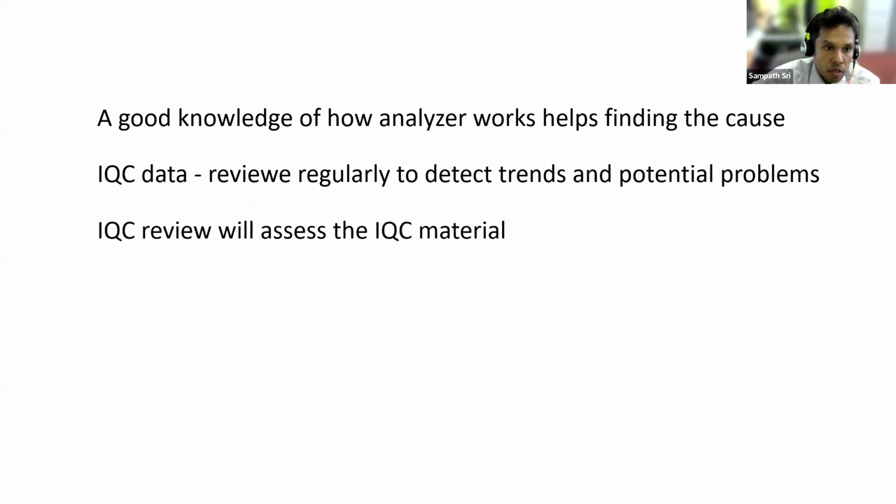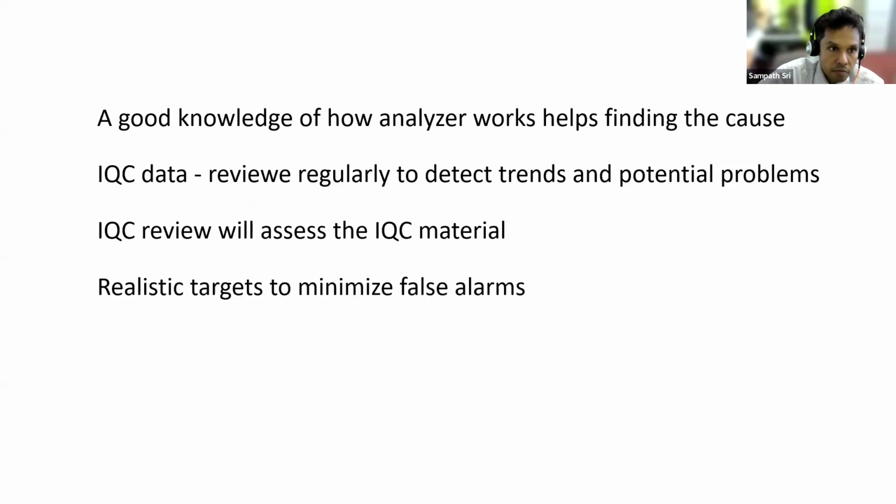Then we should have IQC review, and with the IQC review, it will tell us about our IQC materials, because if the material is changing, it will show in our Levey-Jennings charts.